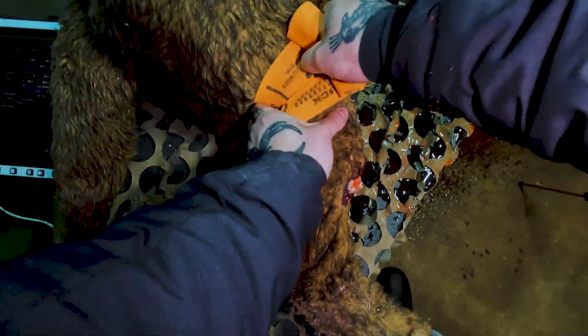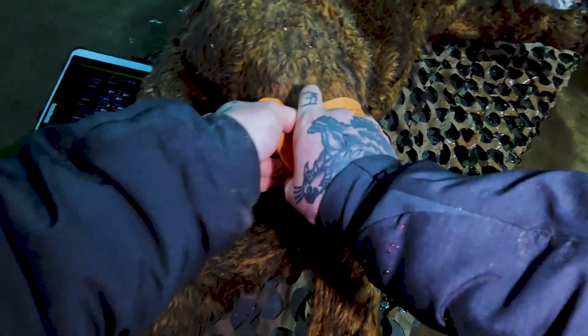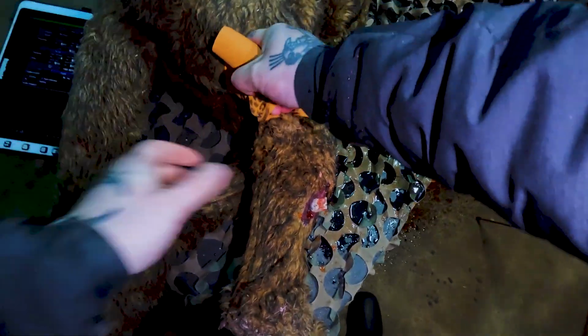So you have the blood stopped by squeezing. Take the ACE wrap, not ACE wrap, SWAT-T, and stretch it around the leg. You can kind of see, you know, those rectangles turning squares, and keep wrapping it until the bleeding stops.